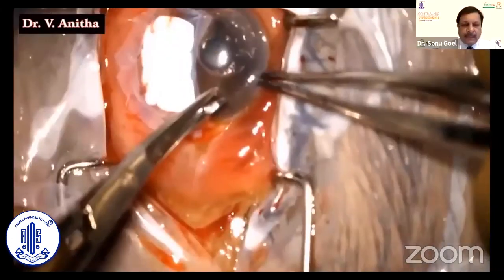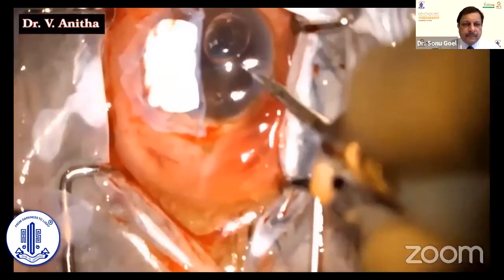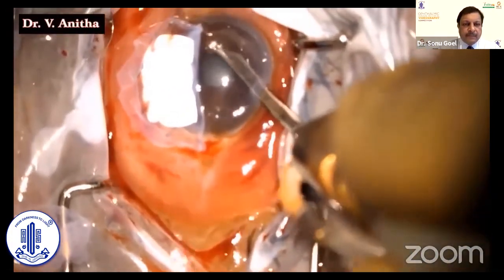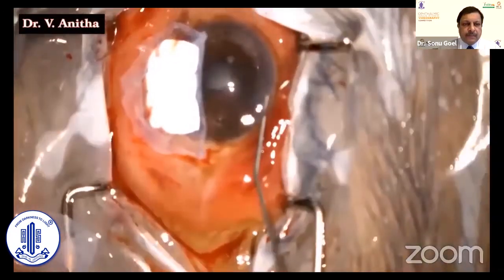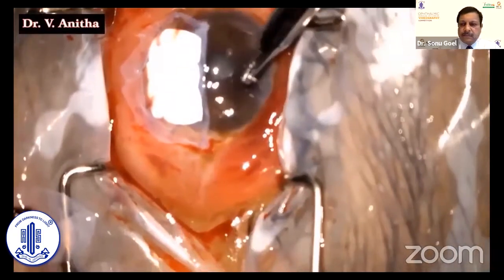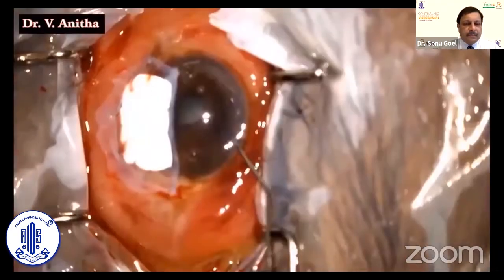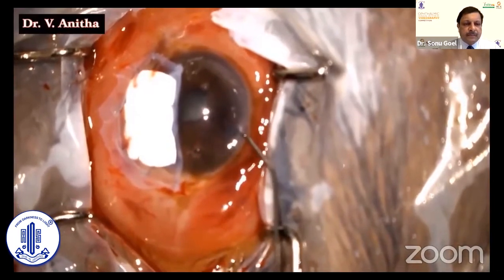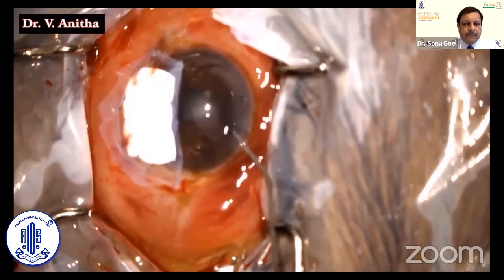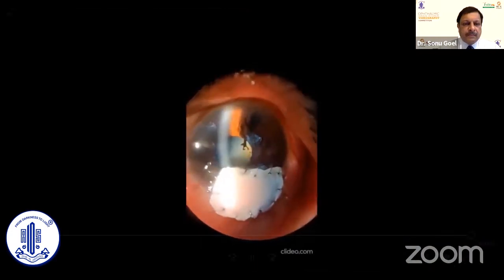Amniotic membrane was covered over the Gore-Tex. The peripheral iridectomy was made and the anterior chamber was thoroughly washed. Intracameral antibiotics and antifungals were given. The anterior chamber was tightly formed. One week later, the anterior chamber was well formed and the eye was quiet, with the Gore-Tex in situ, avoiding the need for urgent keratoplasty.